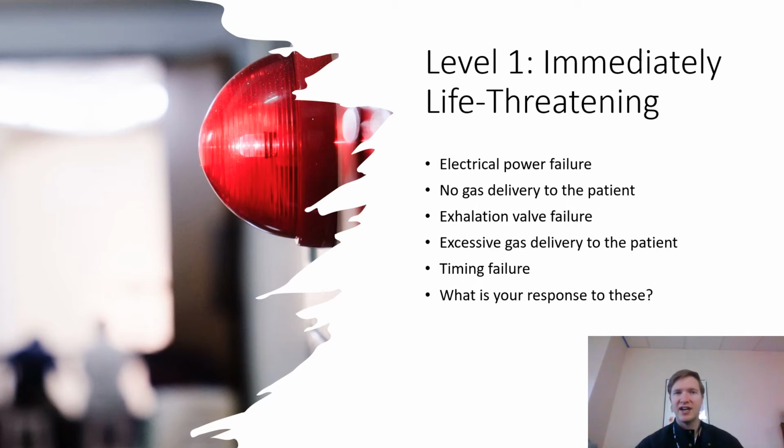Timing failure, like an I time too long alarm, you've seen those things. That could be a sign of a disconnect, or maybe their chest tube is leaking, right? Something like that's going on. So your response to these is going to be very significant, right? Very significant when you're looking at these.